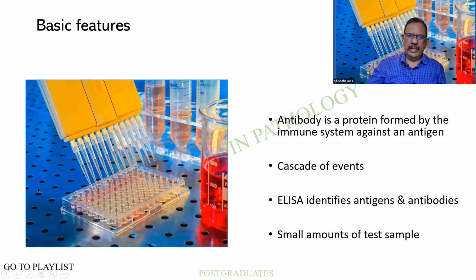And what we are seeing on the screen is amazing. There is a set of 96 wells, and these are fed with the sample, which is being delivered to each of the wells. The wells are fed, and then subsequently you find that the antibody, etc., is being added. You find that the microtips will be discarded. In this one, normally you find that there is a single sample for a single test, but sometimes multiple samples for multiple tests can also be used. Such is the advantage.